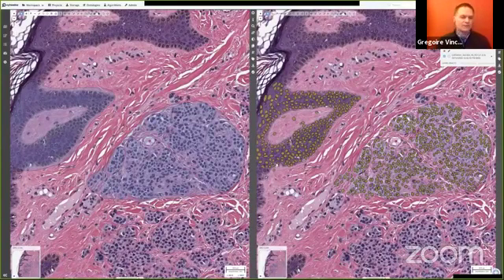In our job, it's pathology. So here you have the same images, with the region of interest on the left, where the AI has been run, because we also have the possibility to run the AI only on a short part of the image to not consume too much energy.